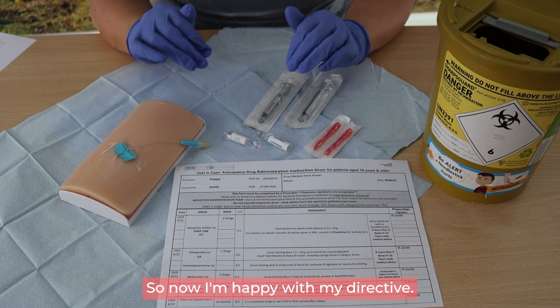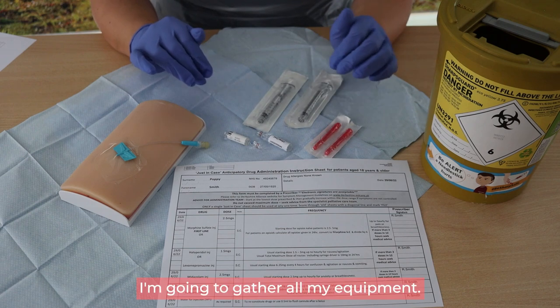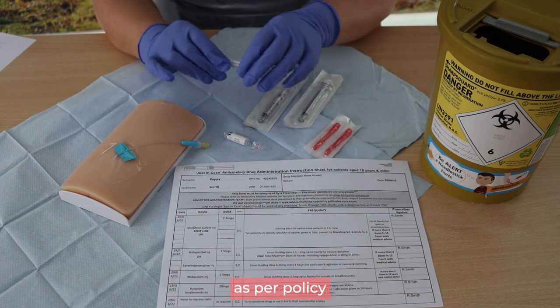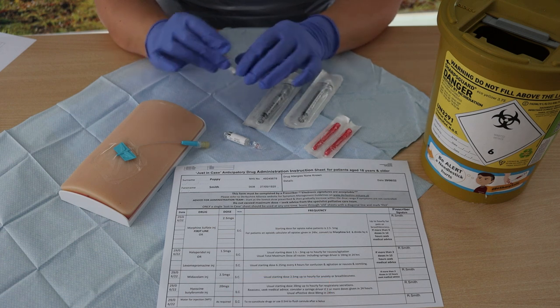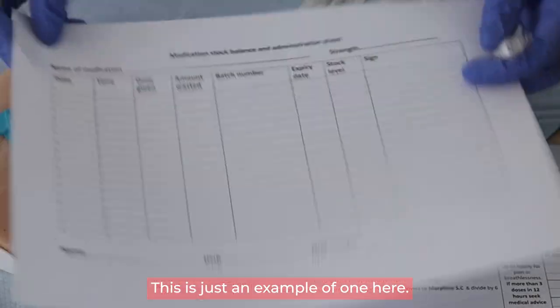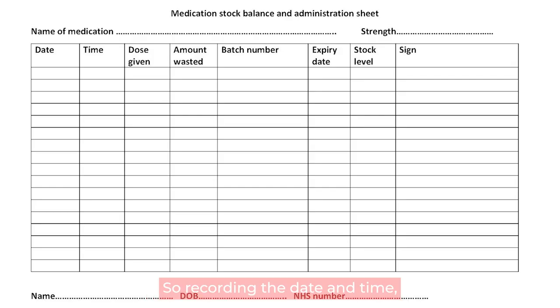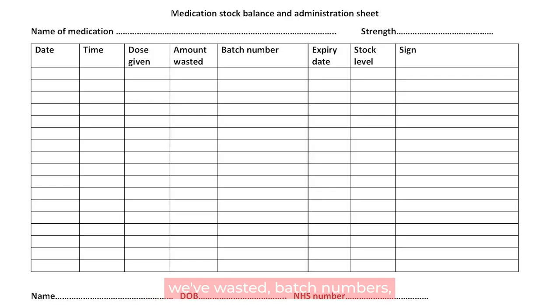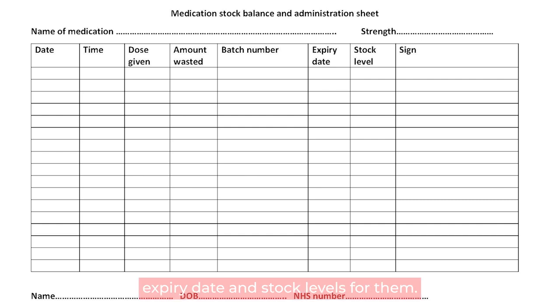Now I'm happy with my directive, I'm going to gather all my equipment. I'm going to book out my medication as per policy and record using my stock balance sheet. This is just an example of one here — recording the date and time, the dose given, the amount wasted, batch numbers, expiry date, and stock levels.